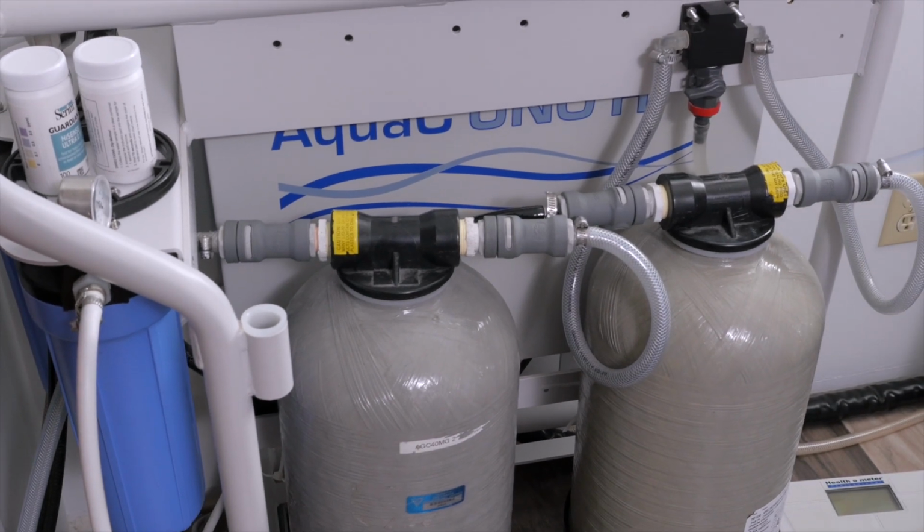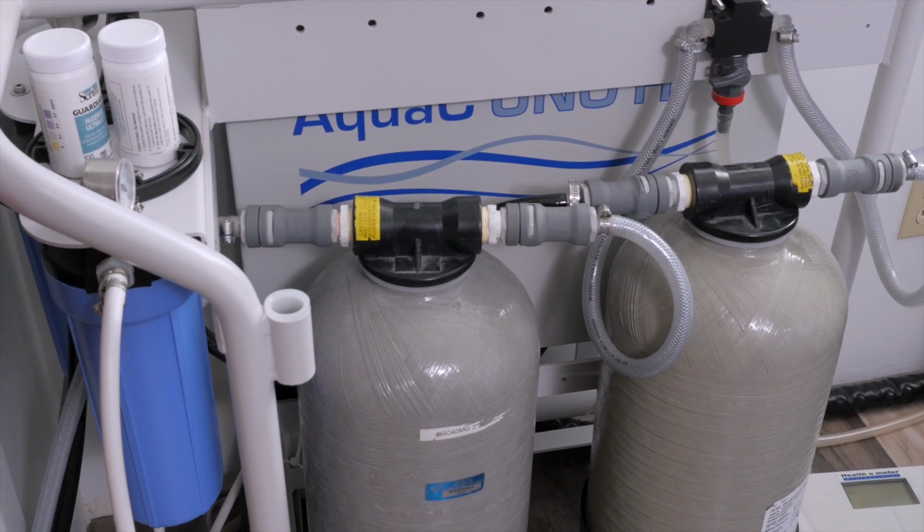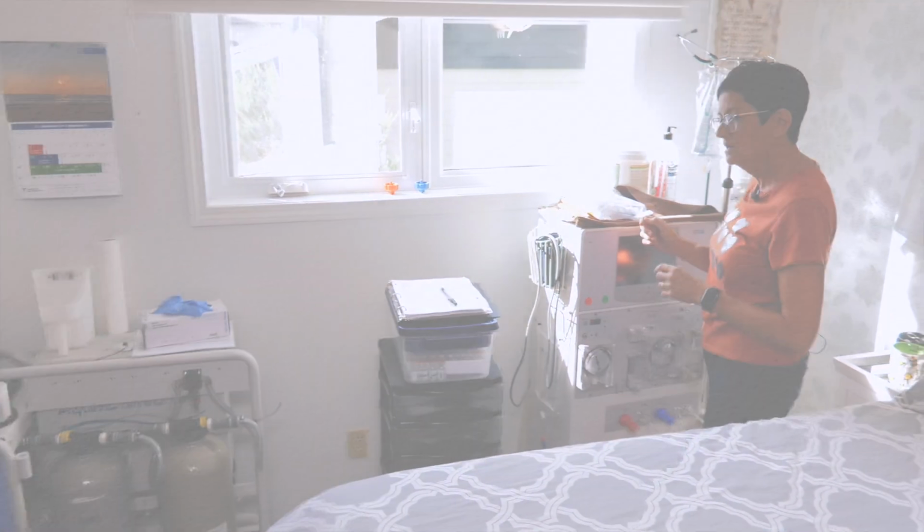So this is my reverse osmosis machine. I start it on 10 minutes before I actually start setting up the treatment. We got to let it run for 10 minutes.